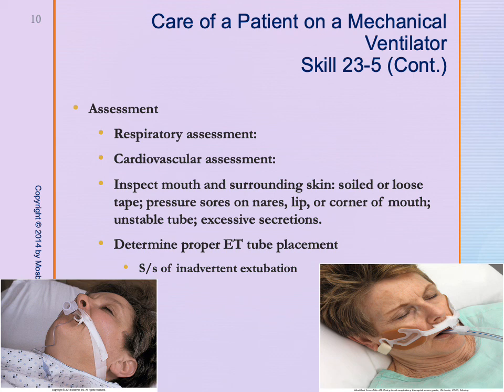We will inspect the mouth and surrounding skin. If there is an endotracheal tube in place, there is a risk for increased pressure on the mouth, or if it's in the nares, on the nares. If there is a special tube holder or tape is used, you would want to also check for tube placement.